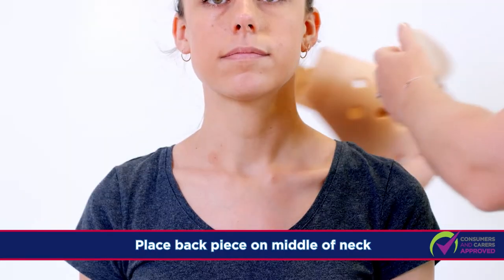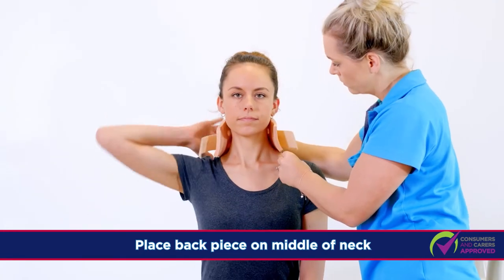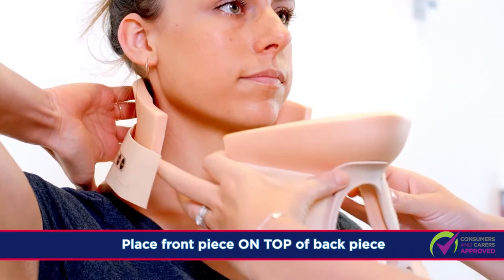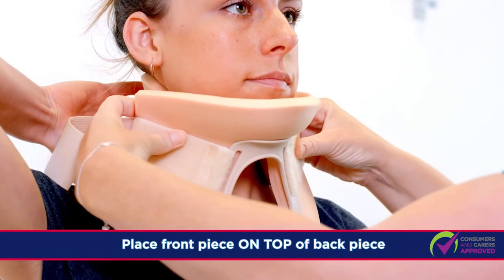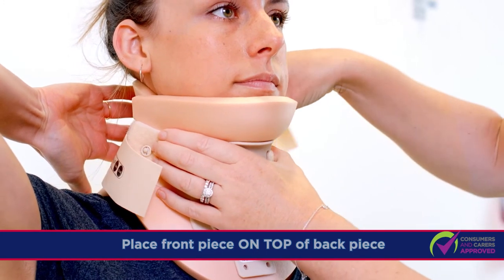Place the shower collar back piece on the middle of the neck. The patient can help hold the back piece. Place the shower collar front piece in the middle of the neck and on top of the back piece. Secure with both Velcro straps.